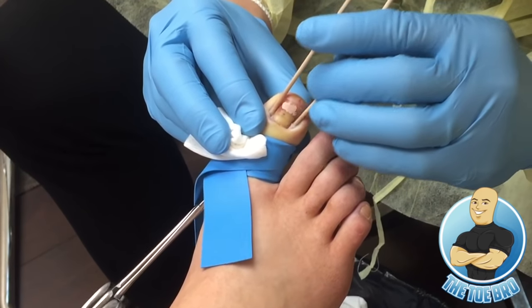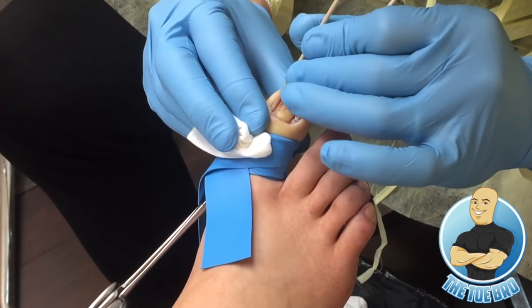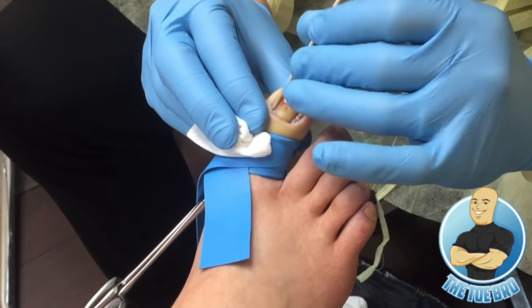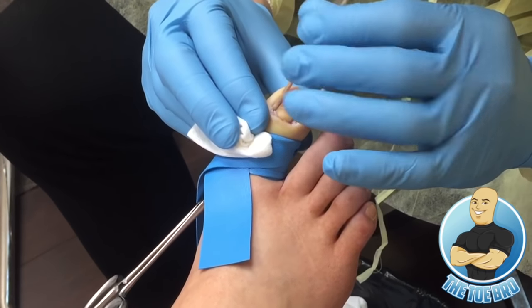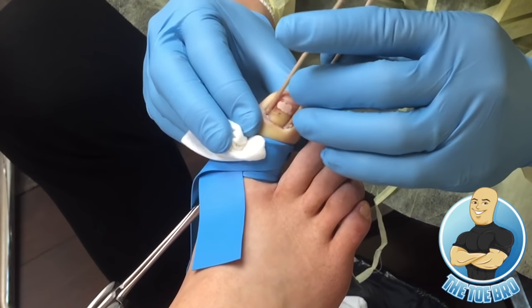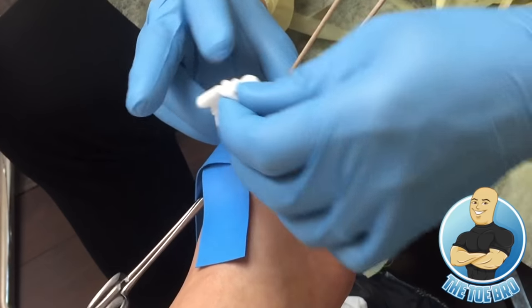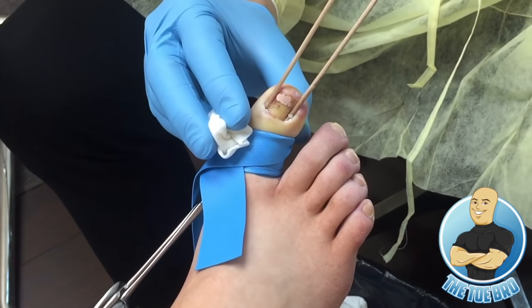So what we're doing is we're applying the cotton tip soaked with the acid underneath the cuticle where the nail matrix is. We do 3 to 4 rounds of this application of acid, and this will actually stop or kill those nail cells from ever growing again. And this is gonna prevent any sort of regrowth of nail on the sides.